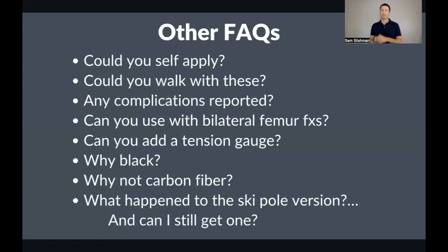Can you add a tension gauge? This also comes from the Sager as well as the Donway. With both of those, you have some ability to gauge the tension. I've actually built a tension gauge, and there's a way to do it, but I don't want it.